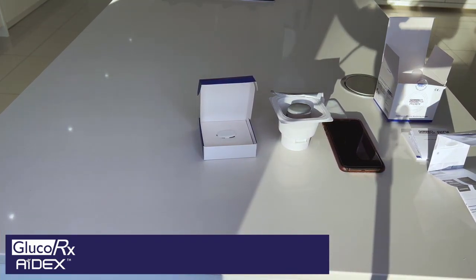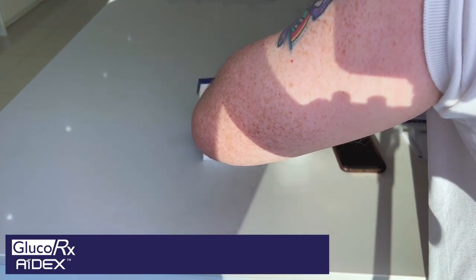So now we've set the app up, we're ready to go. All we need to do now is apply the sensor. For this sensor, I'm going to apply it to the back of my arm.